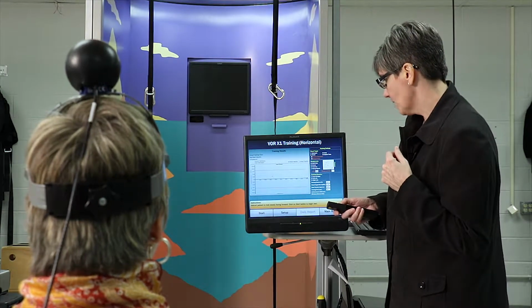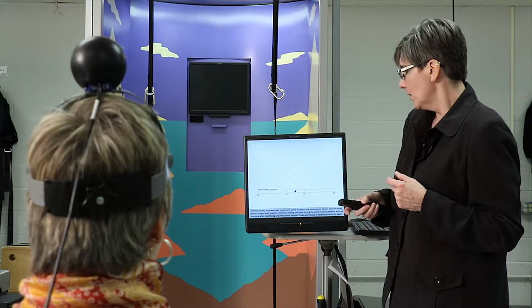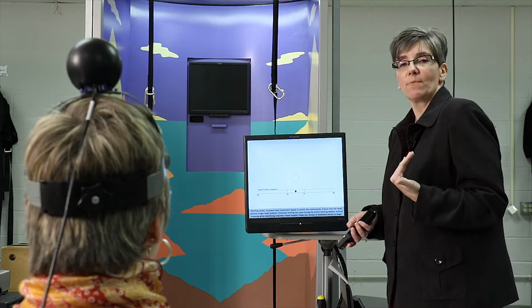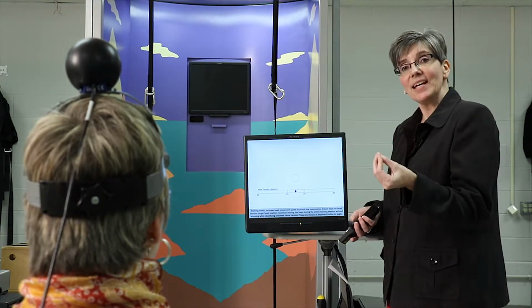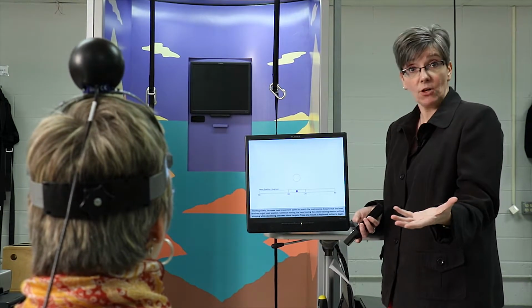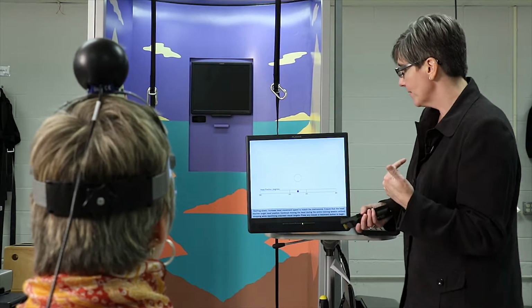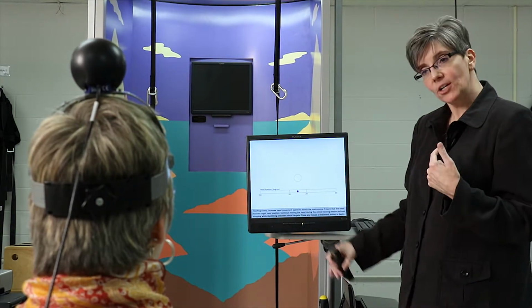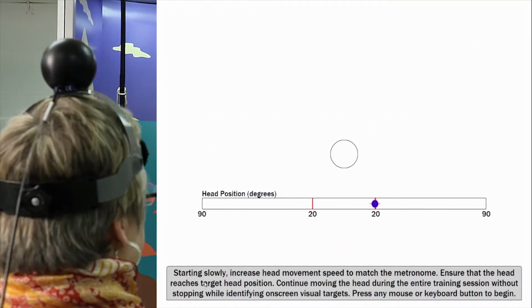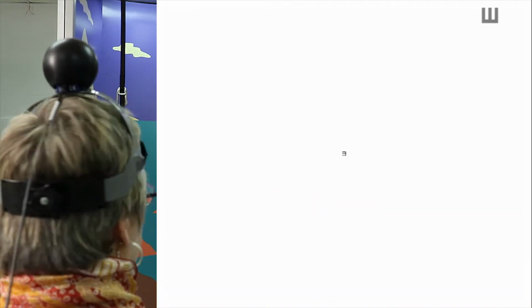So Mary, are you ready to do some training? I'm ready. All right, when I click on the start button, what's going to happen is that ping you hear is the metronome. The metronome is the same speed at which she would do this exercise at home. So if she has a metronome app on her phone, she can do this exercise at home at the right speed. Now Mary, here are your distance markers. Okay. I want you to hit each marker to the beat of a metronome. Good. Now when she's got that, I click the start button.